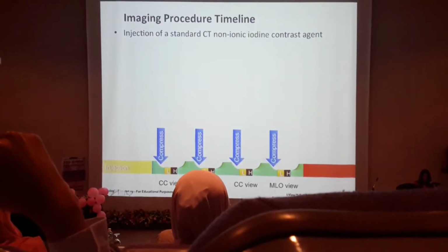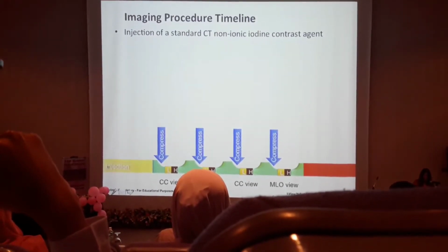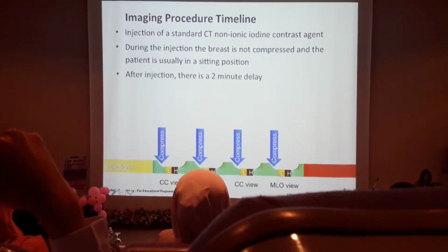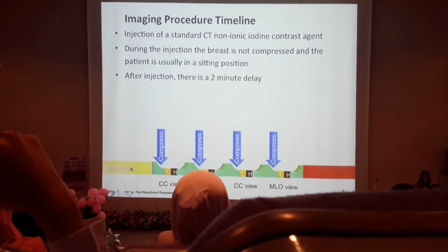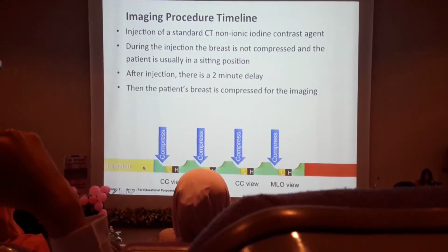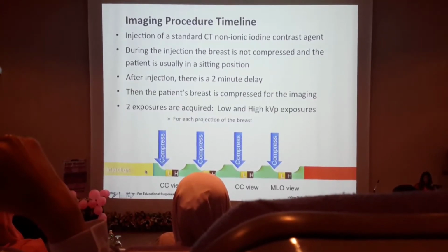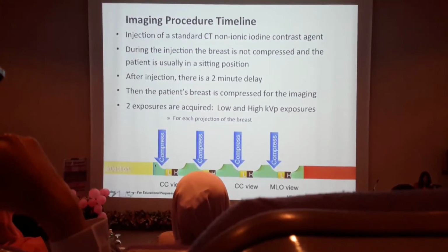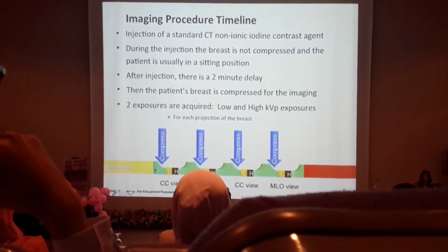So our system comes with a very beautiful timeline, which the radiographers will have in front of them, so they know that this is where you start the injection. They've got 2 minutes to remove the injector, and the patient is able to walk to the mammo machine during these 2 minutes of the yellow phase. From these 2 minutes at this green zone, they start imaging.